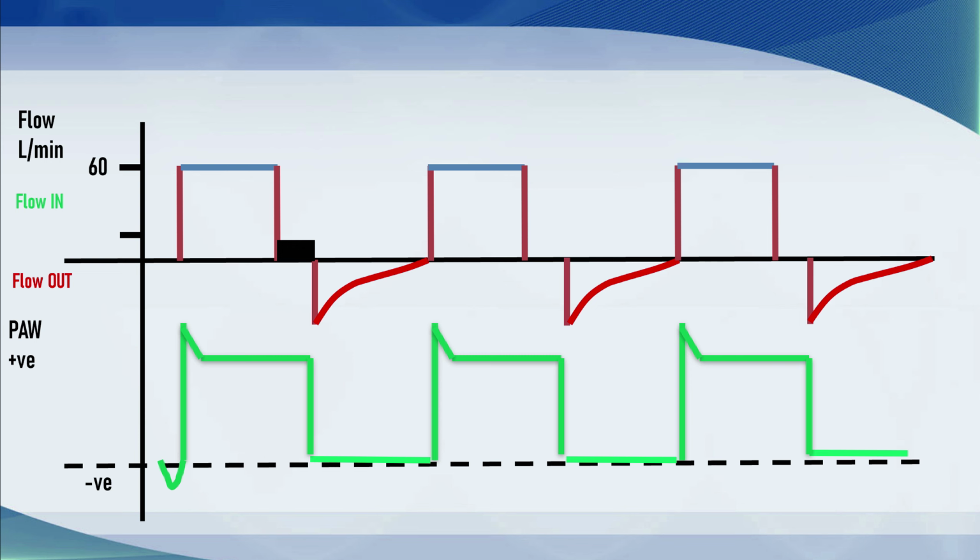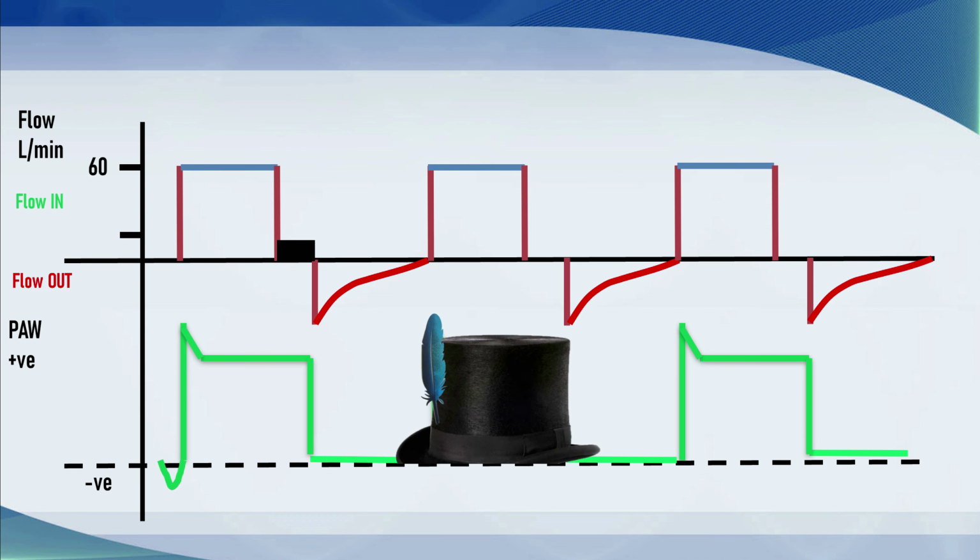In my view, and this is just my view, it looks a little bit like a top hat with a blip at the top of the waveform that falls down to a ledge. So this is the picture I think of when I see that waveform. The blip at the top represents the peak pressure. That's the pressure within the airways. And the flat top bit is the plateau pressure, and that's the pressure that's seen by the alveoli. So this is volume assist controlled ventilation, because you can see the little divot before the first breath, with an inspiratory pause.